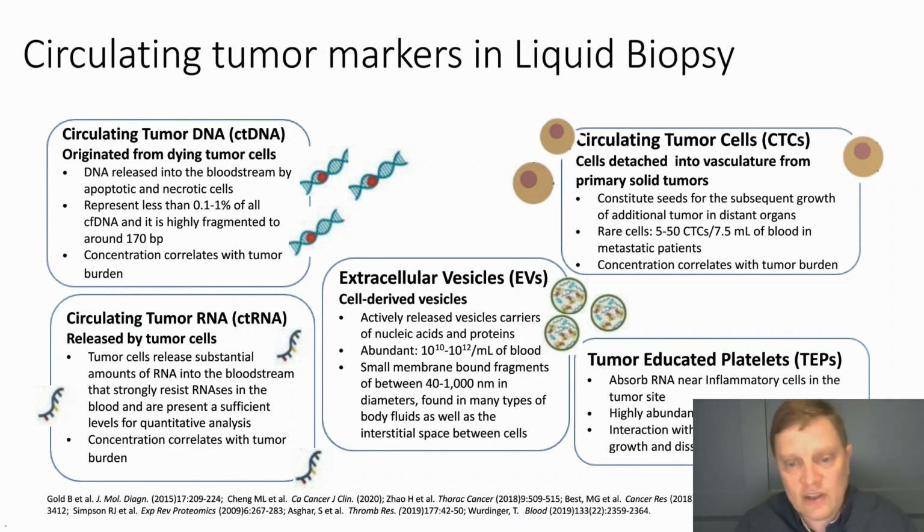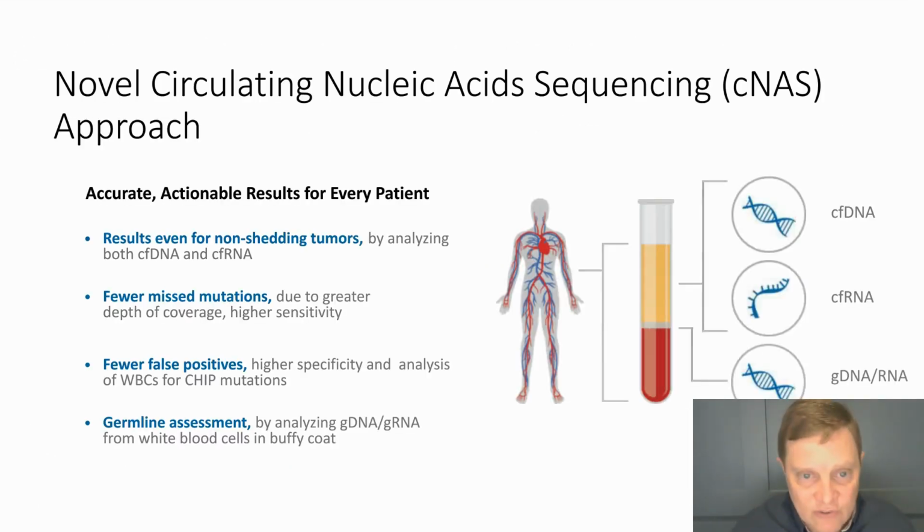And so as we're measuring these, the context of what we're doing is of critical importance. Because if we just look at what's in the plasma, we're missing something. What we're missing is what's in the buffy coat, that genomic component for what's there. And that has a very important role to play that I'll come to in a little bit. But our ability to measure things should be the rate limiting factor, and it's not. And so running smaller gene panels is squandering an opportunity to maximize our understanding on a per patient basis.